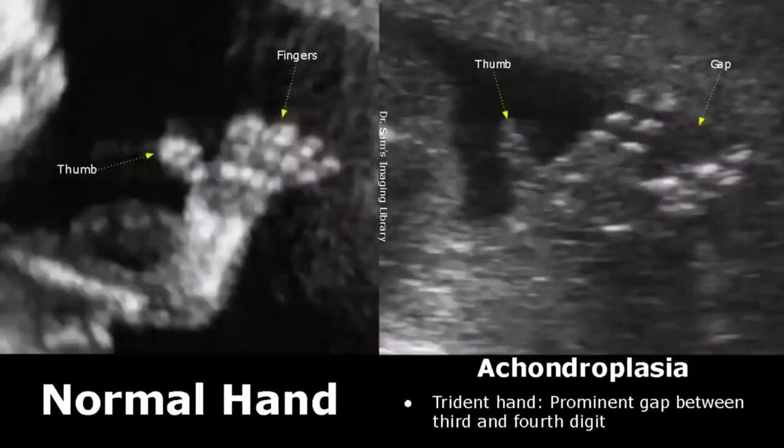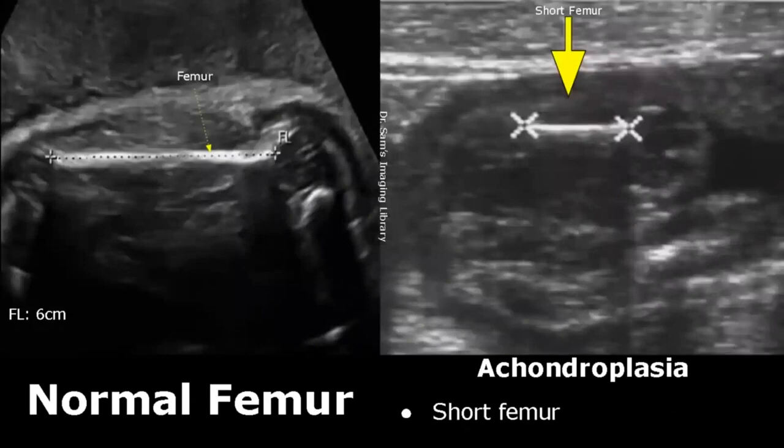Achondroplasia is another common skeletal dysplasia. A trident hand is one of its features. You will find a prominent gap between the third and fourth digits. A short femur is also a feature of achondroplasia. The femoral length is shorter than expected for gestational age.